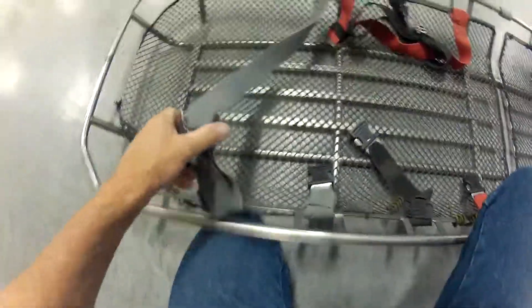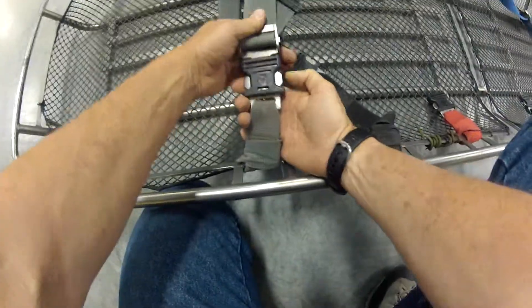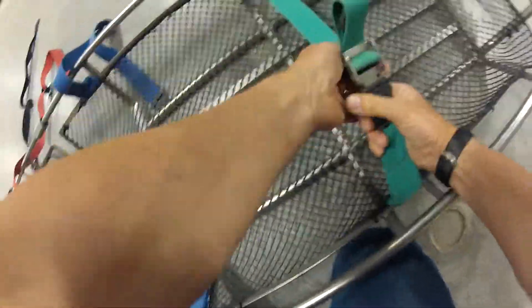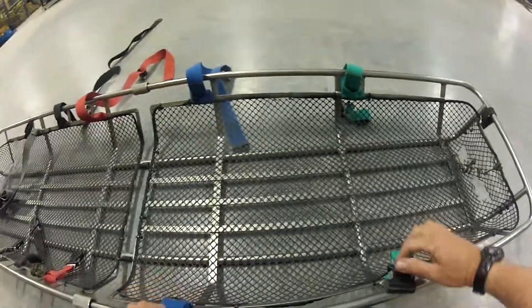I also like to inspect and make sure that all these buckles will operate. I'm not going to show you all of them, but just checking them out — make sure they're intact, inspect the webbing, make sure that it's all in one piece and that it is attached correctly. Do all of these, and put them out of your way when you're putting your patient in.